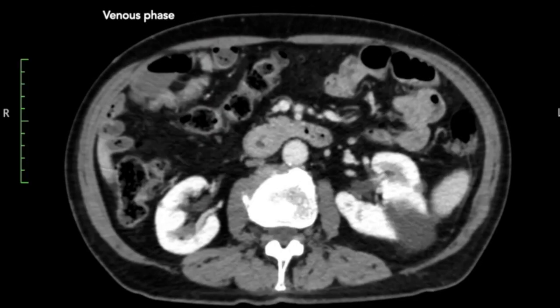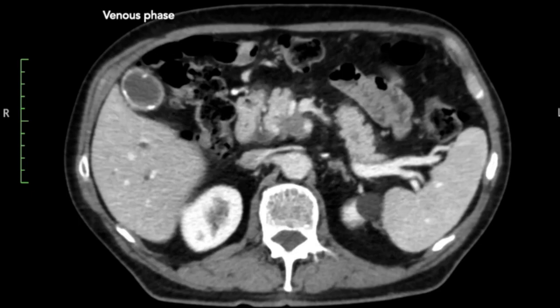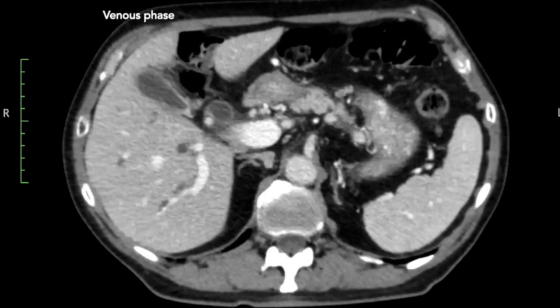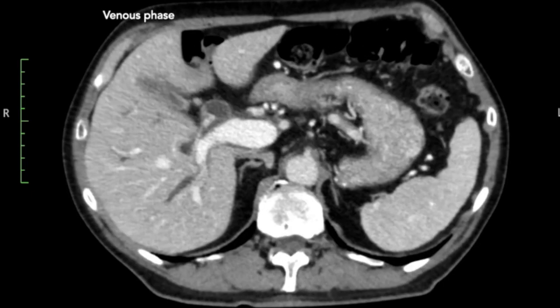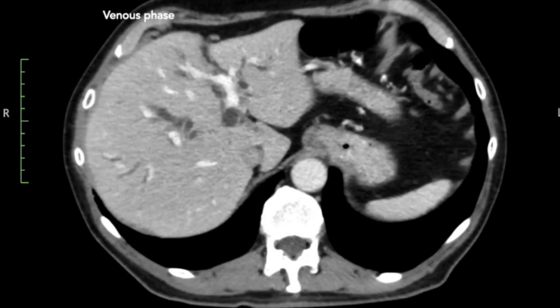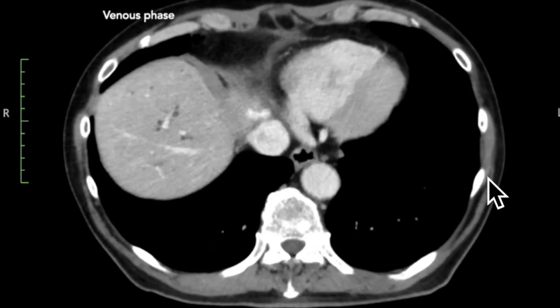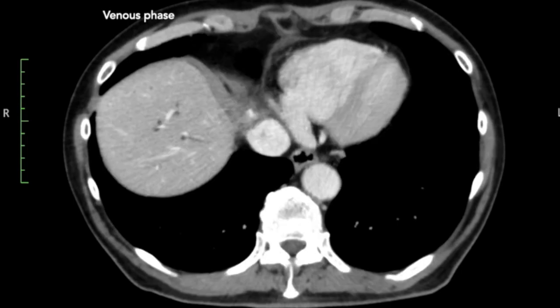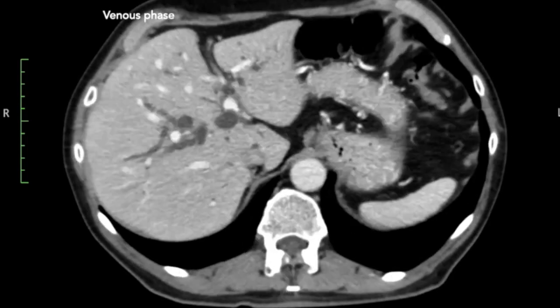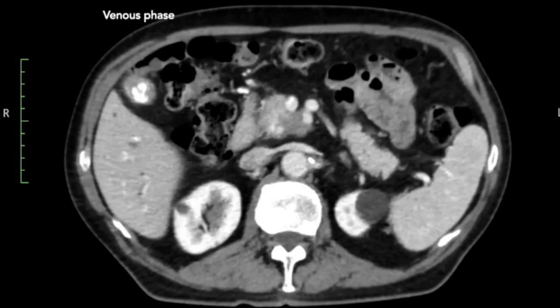The next step is assessing lymphadenopathy. No suspicious lymph nodes were seen. Looking for distant metastasis, in this case a hemangioma was noted cranially in the left hepatic lobe, but no liver metastasis or metastasis at other locations were seen.